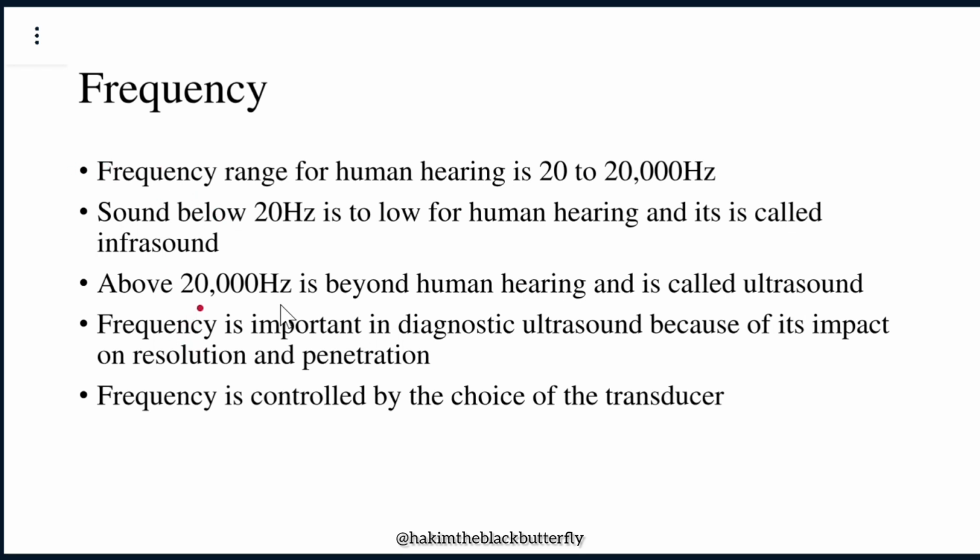This is a repetition of what I talked about at the beginning. The reason why we talk about frequency so much is because it is very important in diagnostic ultrasound because of its impact on resolution and penetration. Because it has an impact on resolution and penetration of the beam, frequency is controlled by the choice of a transducer. We have transducers that have higher frequencies. We have transducers that produce low frequencies.